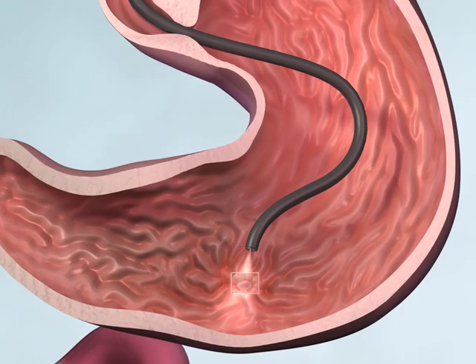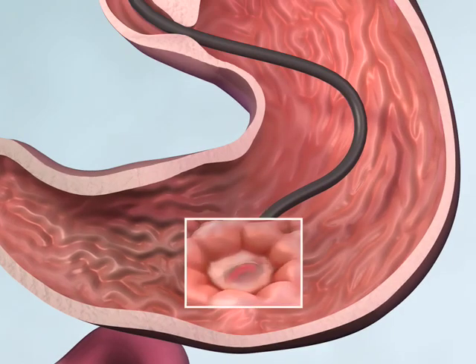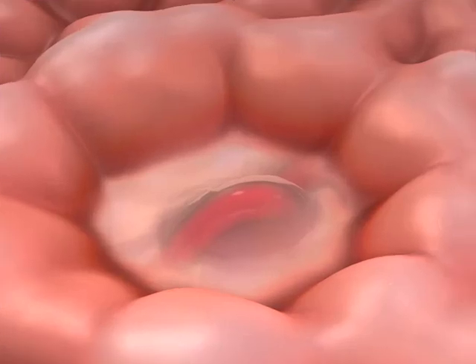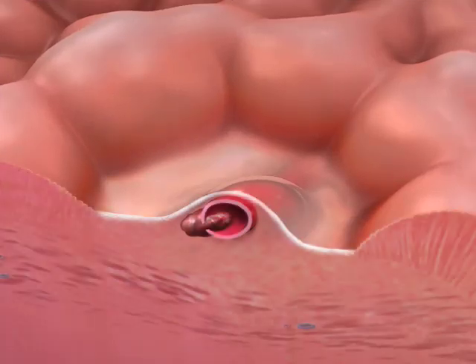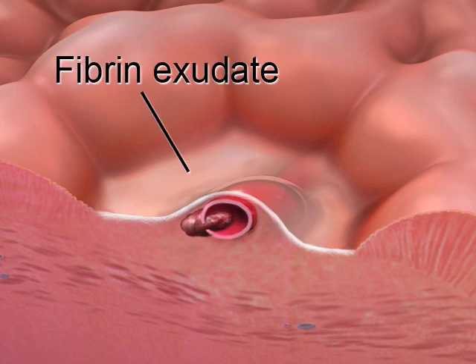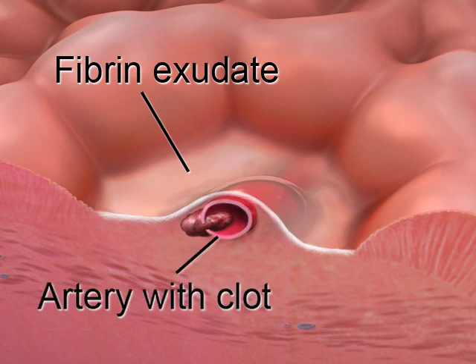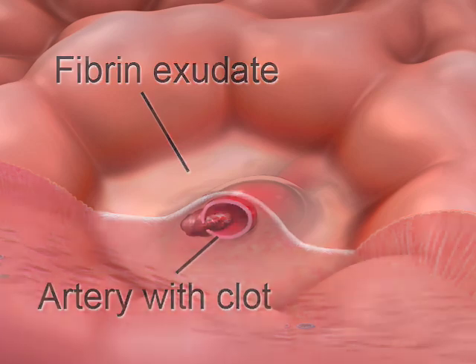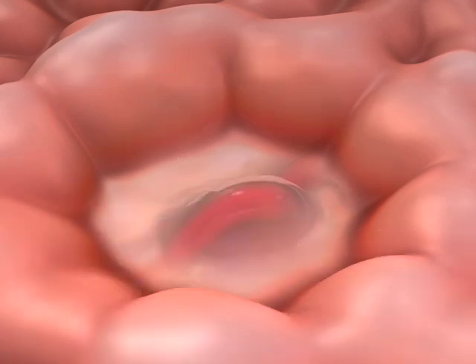The peptic ulcer, in this example, has eroded through the mucosa and submucosa into an underlying artery that produces the bleeding. The ulcer base is covered by a fibrin exudate. The non-bleeding visible vessel, composed of the artery and clot plugging the defect in the side wall of the artery, appears as a nipple-like protuberance in the ulcer base.